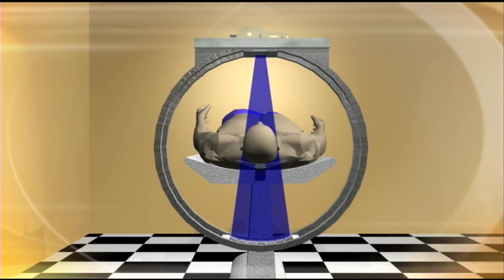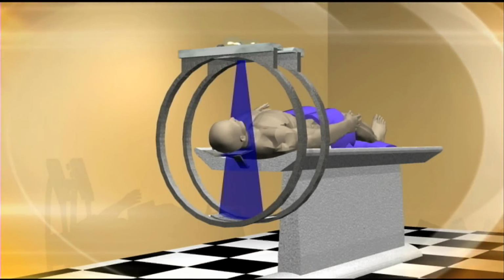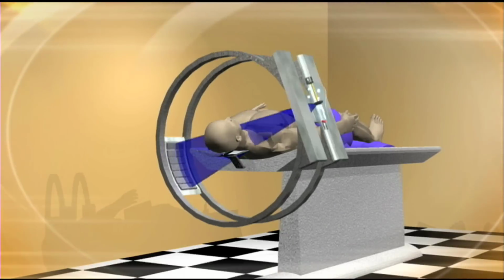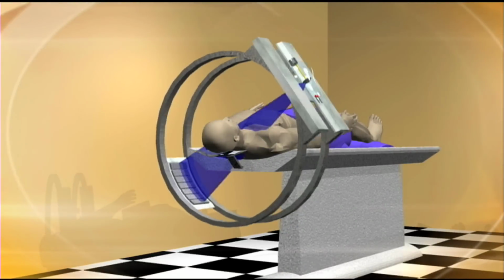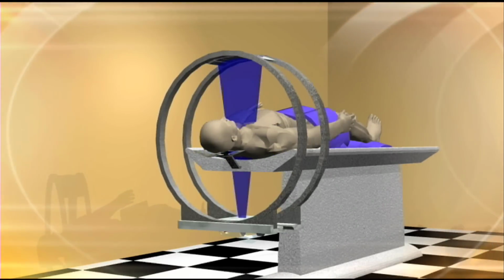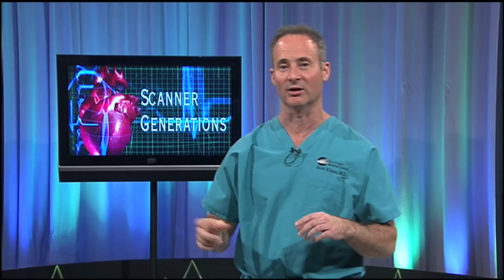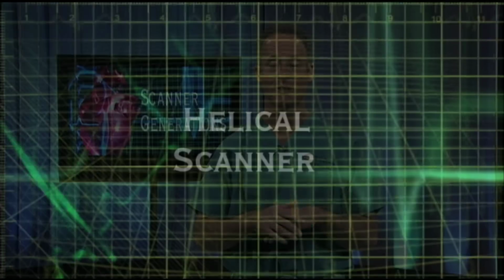So what would happen is you would start with the head in one position, and you could actually rotate 180 degrees, and the gantry would stop rotation. The body was moved in a little bit, and then it was 180 degrees in the other direction. And the reason you had to go 180 degrees in one direction, stop, and then go back the other way is because all of the equipment was tethered by a whole bunch of wires and power supply. And if you kept rotating in one direction, you would rip those wires right off the scanner, and you could probably use it one time at most.